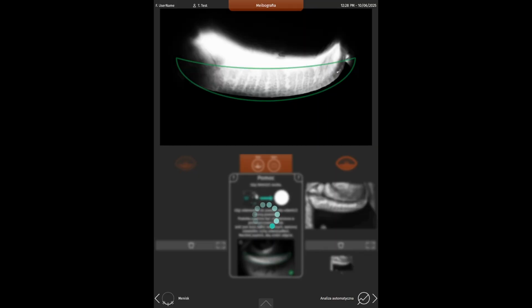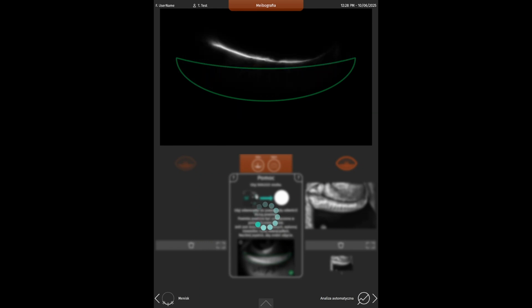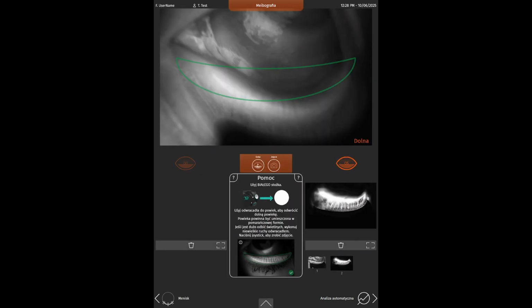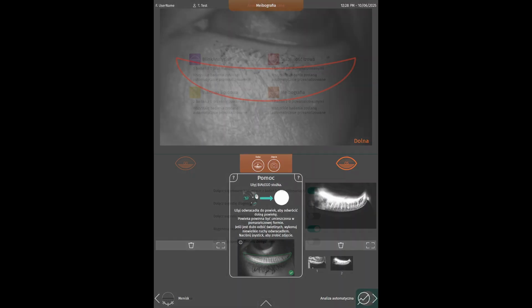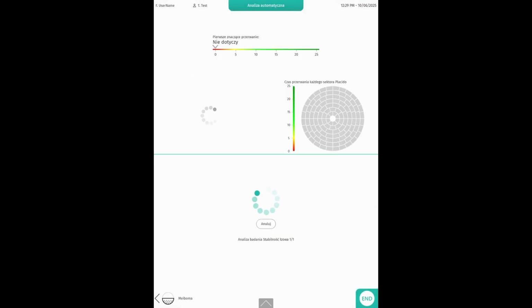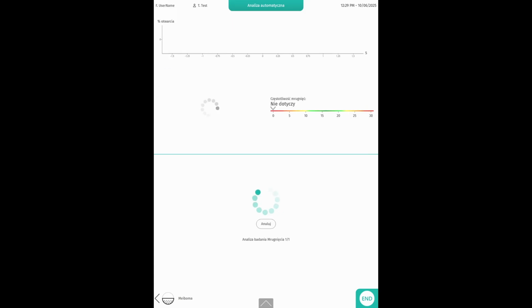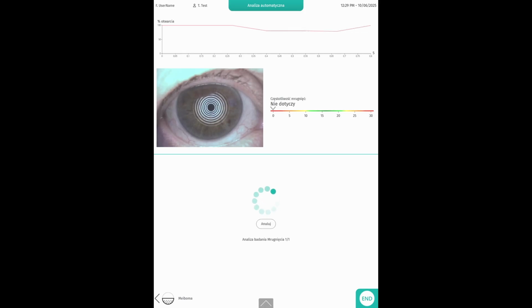And you see the transillumination of the meibomian glands, and you see how and why this is so cool compared to just the infrared that's on the other machines. After you're done with the exam, you can analyze the exam, and it takes a while. So I recommend using C.DIAG first before the slit lamp. Then you take the patient, you have time for slit lamp examination while the machine analyzes, because it takes a few minutes to get the whole analysis done.